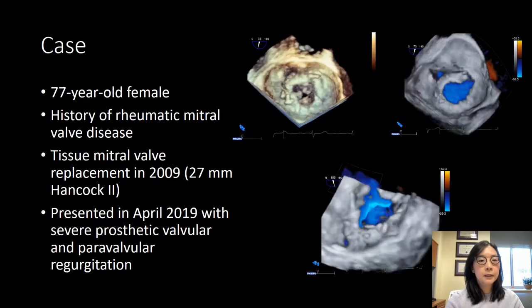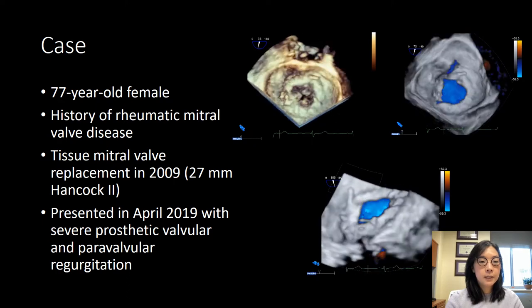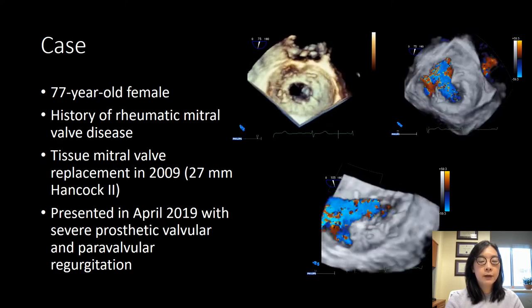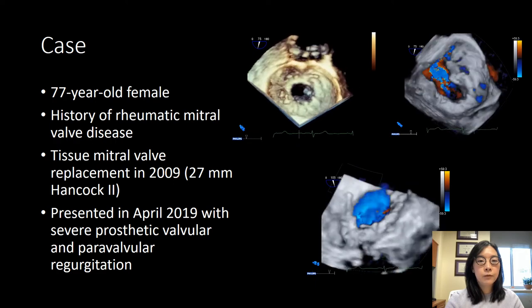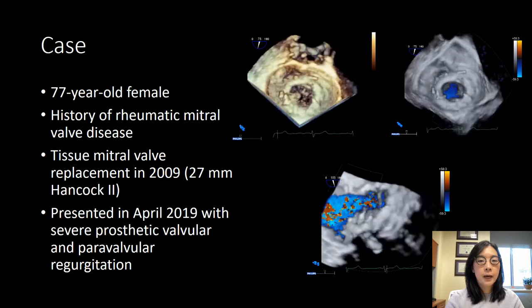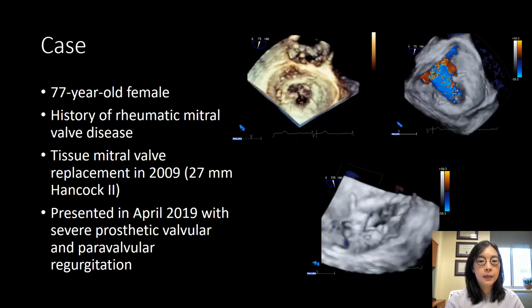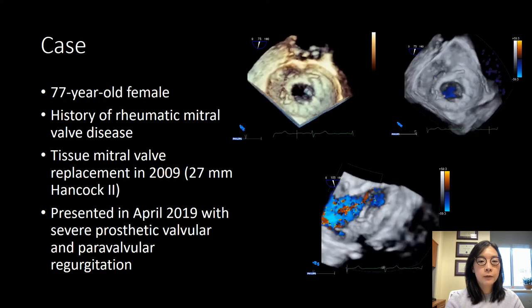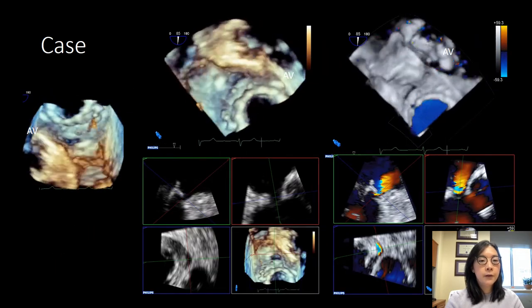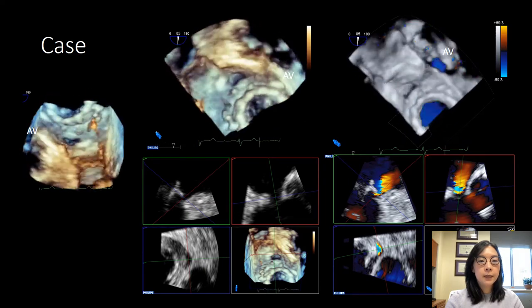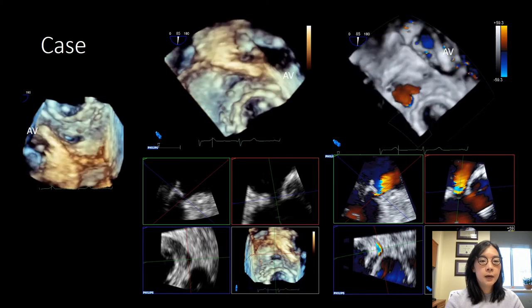This is a 77-year-old female with a history of rheumatic mitral valve disease. She had a tissue mitral valve replacement in 2009 and presented in April 2019 with severe prosthetic valvular and paravalvular regurgitation. The top two images show the bioprosthetic mitral valve with and without color, and you can appreciate the valvular regurgitation jet directed anterolaterally. When we rotate the image off-axis, we can appreciate both the valvular as well as the paravalvular leak. The patient underwent a valve-in-valve procedure to treat the valvular leak.